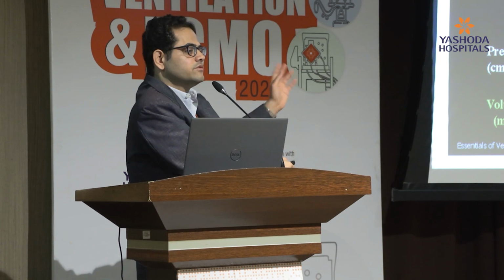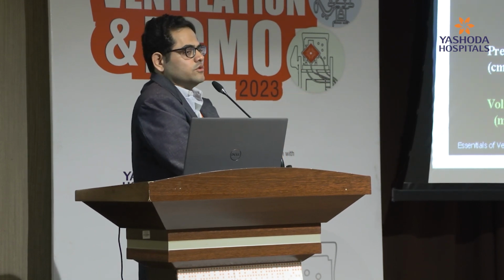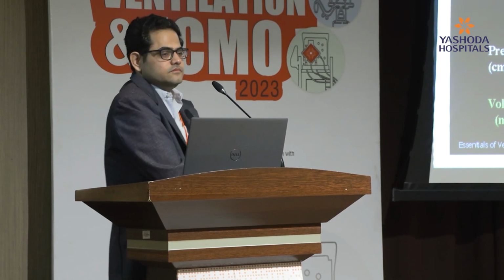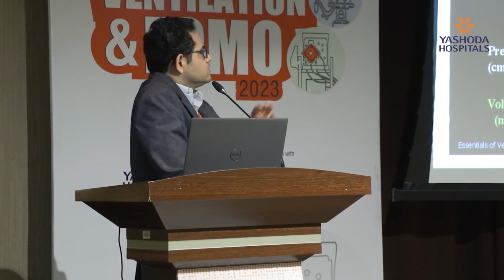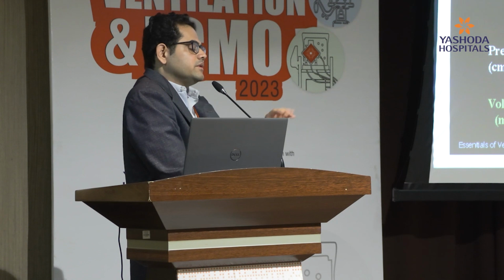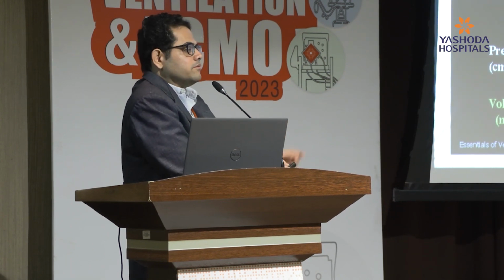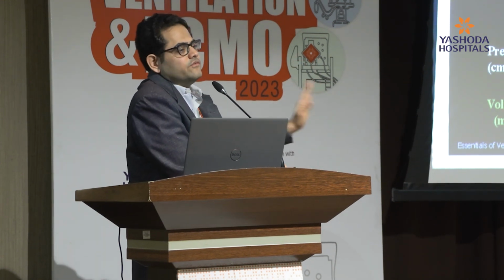So what is the difference between the control mode and assist mode? That is assist control mode, sir. Anybody? So let it be an interactive session. What will happen is in control mode, every breath is controlled by the ventilator. Here, in assist control mode, the patient will be initiating and all the breaths are assisted by the ventilator.